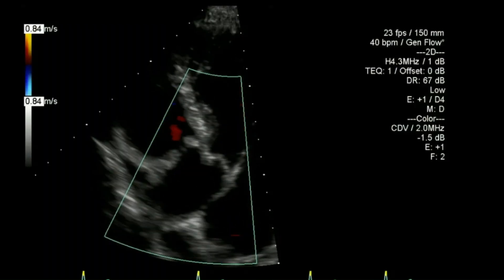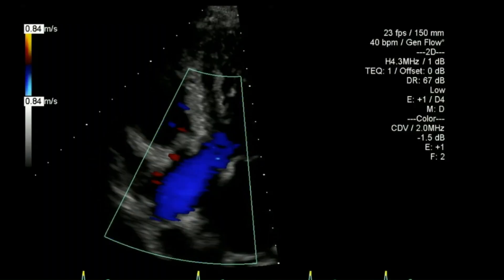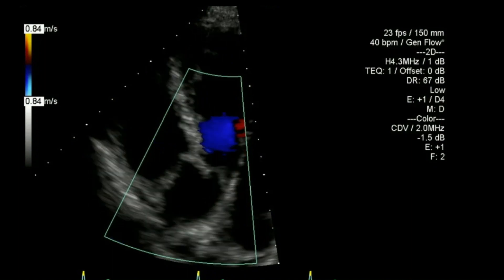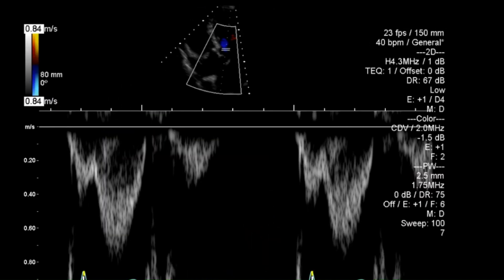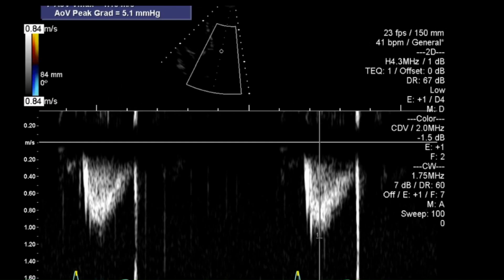Now I've tilted across to look down the aortic valve, and from there I'll do a pulse wave and a continuous wave Doppler looking down that valve.